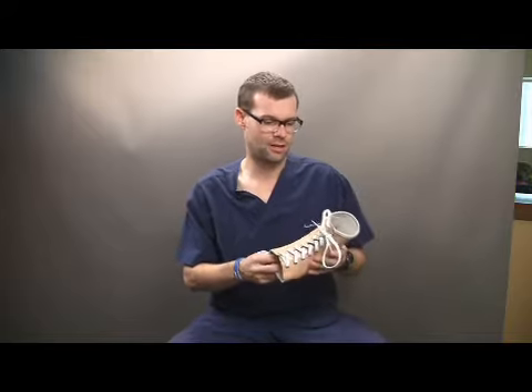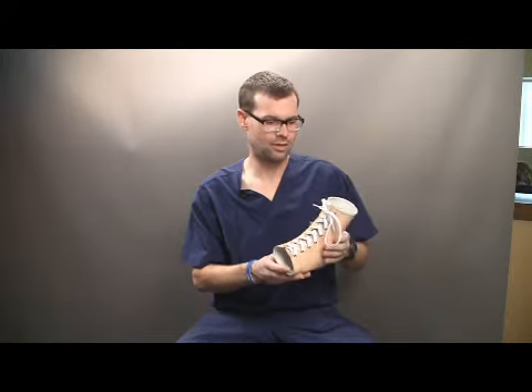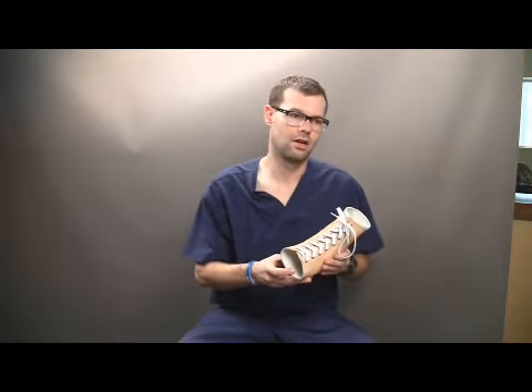One of the main advantages of the Stepwell Custom AFO is the orthopedic grade leather that we use. It's all vegetable tanned, so there's no chemicals. It's hypoallergenic and therefore you're going to reduce the occurrence of any contact dermatitis that a patient might get from utilizing a leather style AFO. Additionally, because there's no chemicals or dyes, this has a natural breathability, so it does have some air exchange.